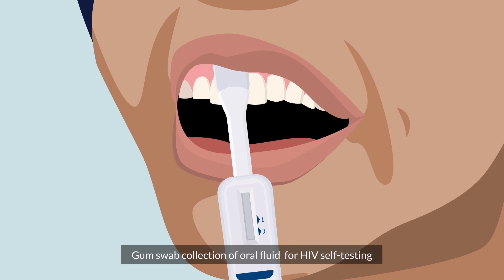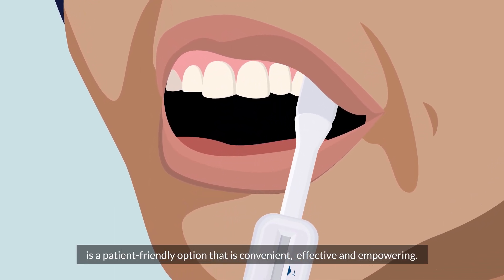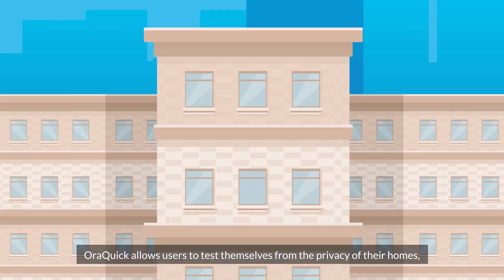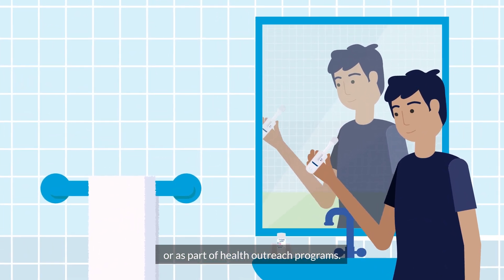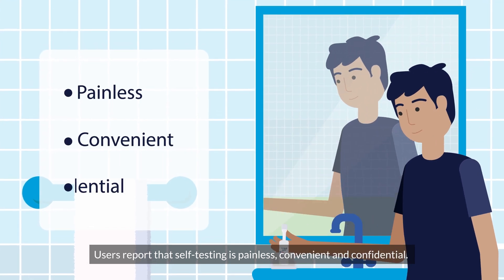Gumswab collection of oral fluid for HIV self-testing is a patient-friendly option that's convenient, effective and empowering. AuraQuick allows users to test themselves from the privacy of their homes or as part of health outreach programmes. Users report that self-testing is painless, convenient and confidential.